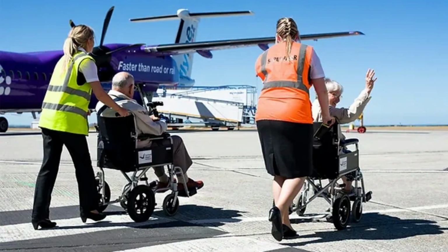Not fun. And as always, we recommend that you arrive at the airport with plenty of time for any unexpected delays. When you check in the first time, make sure they tag your chair correctly. We go into tagging in our other video, which is linked down below. And then when you get to the gate, check again just to make sure that your chair is tagged properly. Lastly, if you need assistance being transferred from your chair and some staff members come over to help you, don't be afraid to tell them how it would help you best, or if there's anything on you that may be hurting that day. It will make the experience much more pleasant for you, and they'll appreciate it.